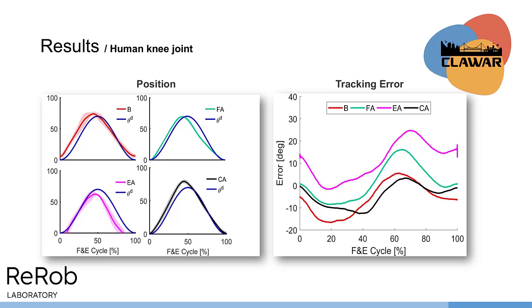However, even in this mode, tracking error suggested that the user did not fully capitalize on the robot assistance, occasionally applying more force than required to align with the reference trajectory. In summary, this finding highlighted the subject's interaction with the exoskeleton in different modes, shedding light on how the system level impacted movement trajectories and the extent to which the user optimized the assistance provided.